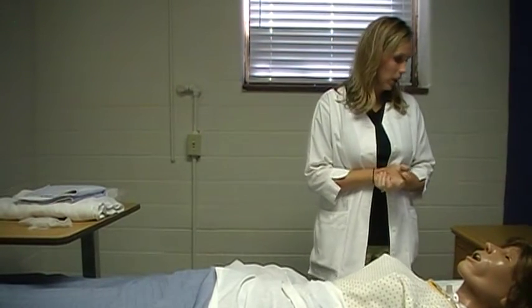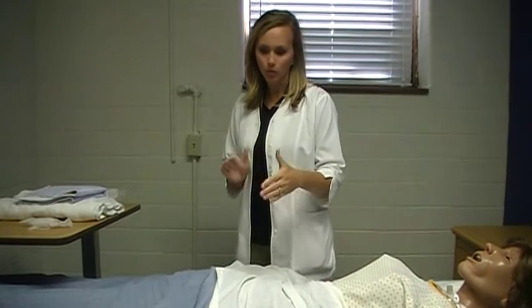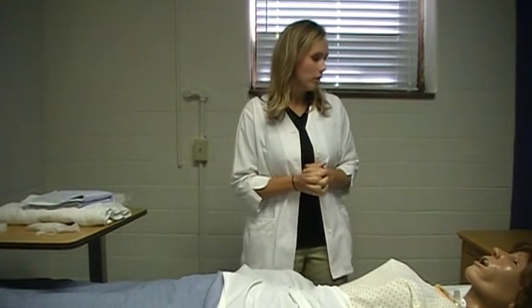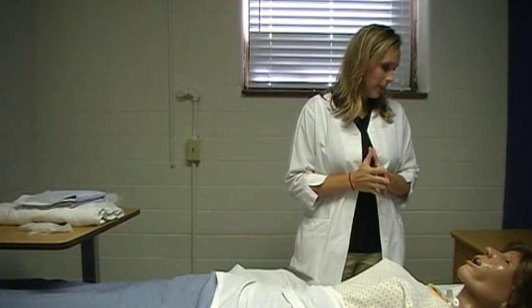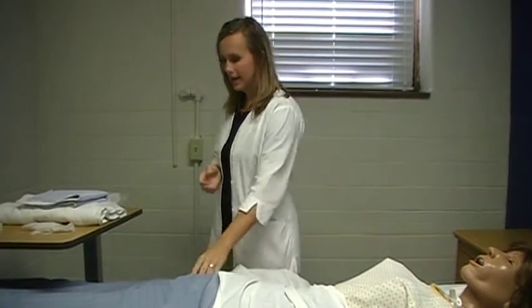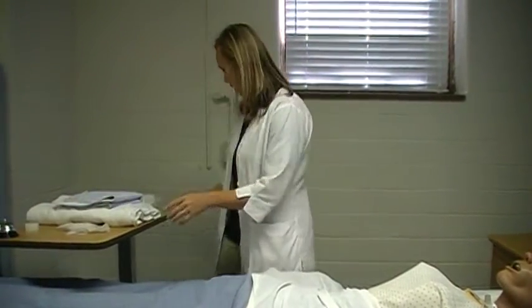If this were a male, we would position them supine and just slightly abduct their thighs. For a female, as noted in the lab manual, we use the dorsal recumbent position with knees flexed, soles of the feet flat on the bed and about two feet apart. We'll do that as we drape her with the bath blanket.